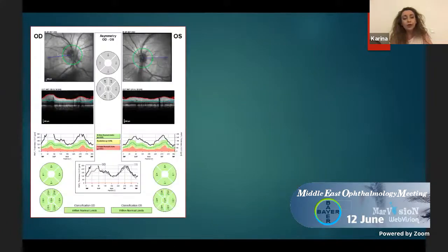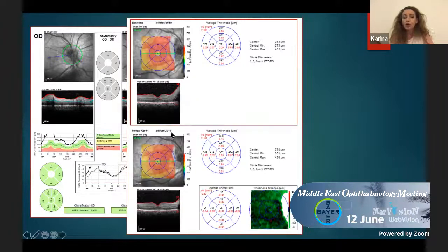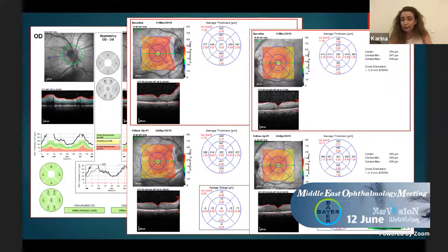So if you see 1 month later, the optic discs are still elevated. So it was not the neovascularization, there's something else besides. Both optic discs are still elevated, no changes at all in perifoveal thickening, and she was under 70 milligrams of prednisone, and same for the left eye.